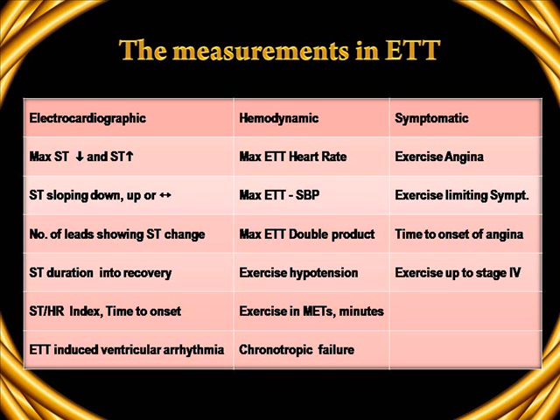While we are doing an exercise test, what are the different measurements that we will be taking? The electrocardiographic measurements, hemodynamic measures, symptomatic measures. Electrocardiographic measurements are maximum ST depression, maximum ST elevation. Is the ST segment sloping down, sloping upward, or horizontal depression? Number of leads showing the ST changes. The duration of ST segment changes into recovery time.